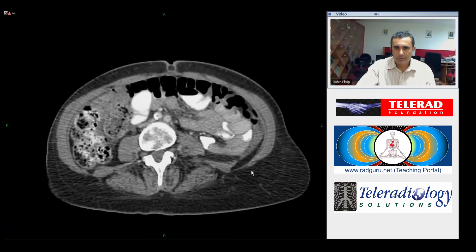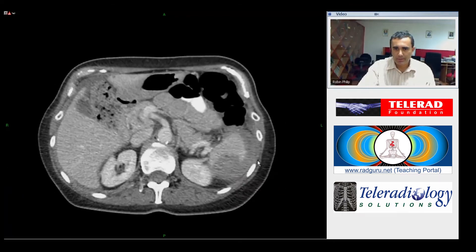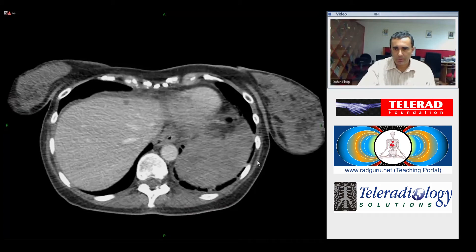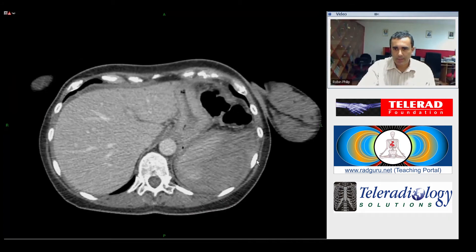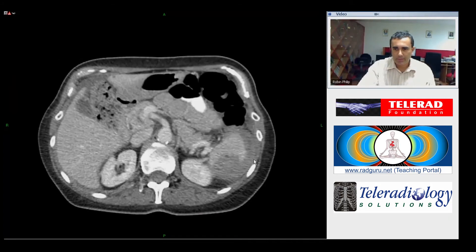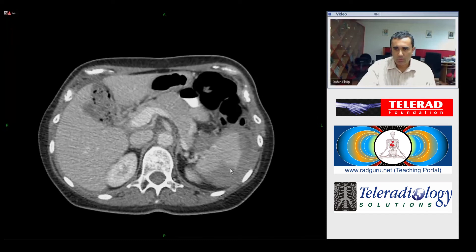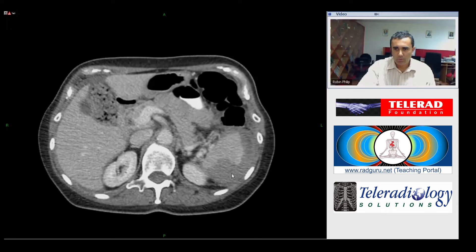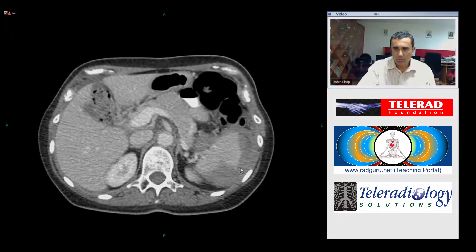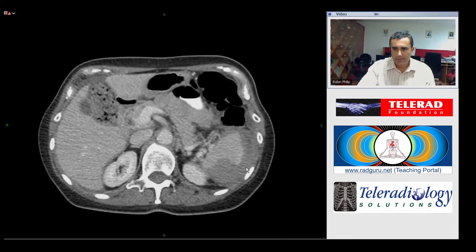Putting it all together in a patient who has undergone recent colonoscopy, this is a case of splenic rupture, where we can see the hematoma that has developed in the spleen and has ruptured through into the subcapsular space.